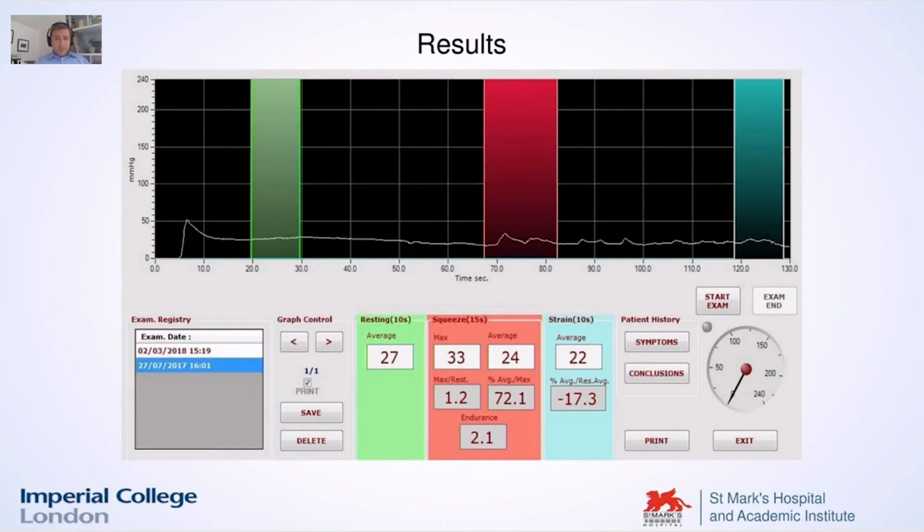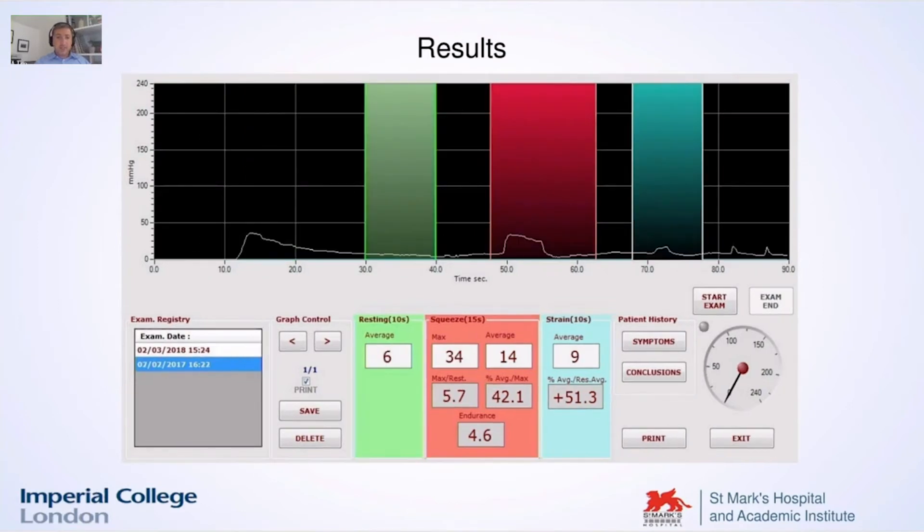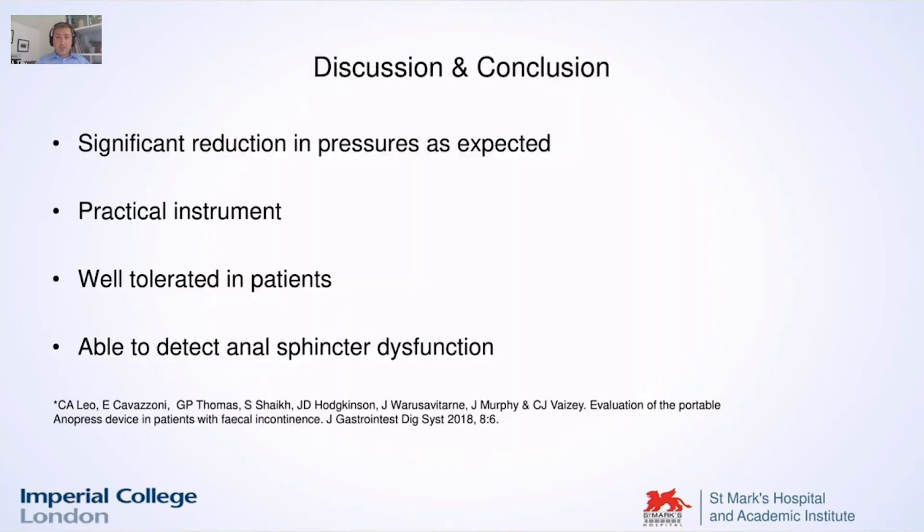Just a couple of examples: you see here very low resting pressure — the squeeze pressure is almost inexistent. Here again, resting pressure very low, nearly to zero. You can already see from the single trace and the numbers that there was a significant difference. Therefore we could conclude that the Anopress is definitely able to detect the reduction in pressures, as we expected. Again, it was a very practical instrument, well-tolerated by the patient, and most importantly it was able to detect anal sphincter dysfunction.